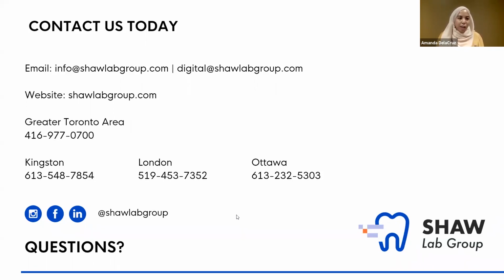But again, if you're doing a big restoration, try to take the pre-op scans as well, just for reference. It's good so we have the buccal contour and everything and have as many things helping the designer as possible. And really, sorry to interrupt, Amanda, but you can scan a full palate, right? You can scan for a denture. You can scan all that information.